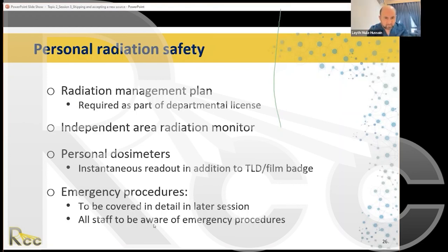And finally, Abu Adibo asked, what was the energy range of scattered radiation of contaminated iridium 192? Oh, wow. That's a really difficult question. I don't think I can answer that. Given that iridium 192 has such a broad energy spectrum, I couldn't say exactly. It could be you have a small part of iridium 192 that's sitting outside of the source and is attached to the cable somewhere where it shouldn't be, in which case the energy range would be the same energy range as the source itself. I'm not sure I can answer it properly. I would say anywhere between 5 keV and 500 keV as a vague guess.